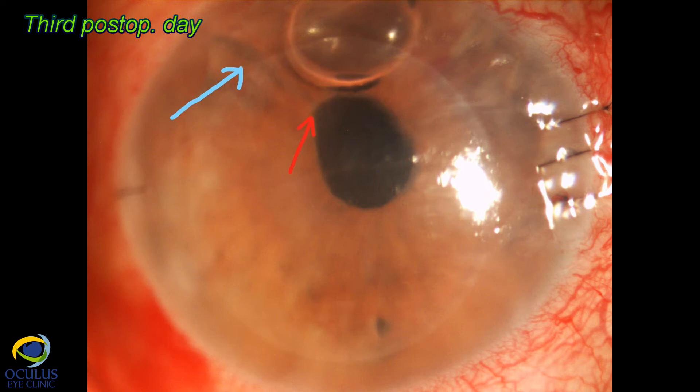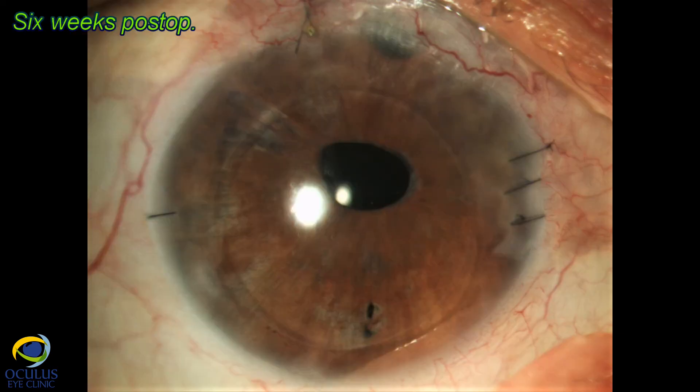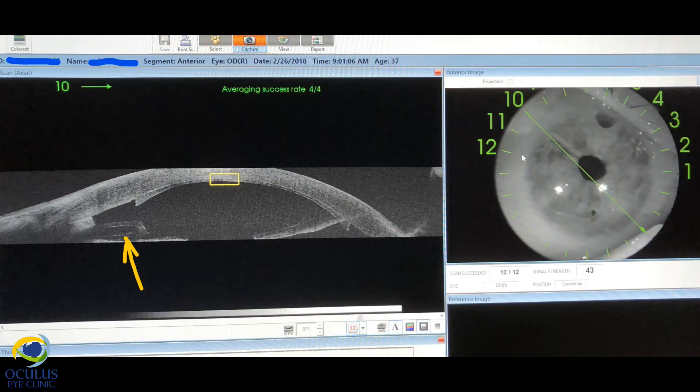On postoperative day three, the lamella looked nice, completely attached to the cornea, transparent with minimal edema. The pupil still showed a slight deformation, but the anterior chamber was free and of normal depth, and the angle was completely open on 360 degrees on both slit lamp and OCT examination. The very thin attached lamella is visible, and the distance from the tube to the graft was a safe distance.